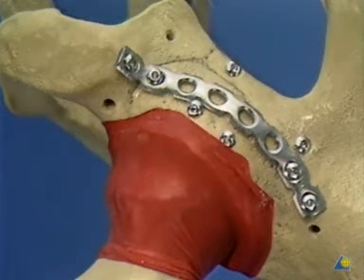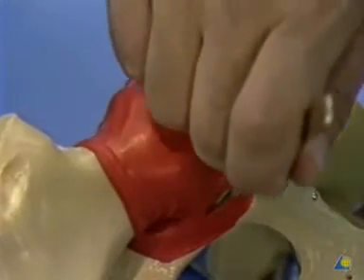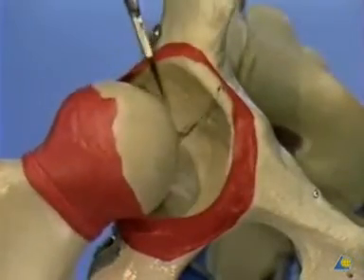The joint capsule is normally left attached to the posterior wall fragments to preserve vascularity and hip stability. For the exercise, we'll open the capsule to visualize our reduction.